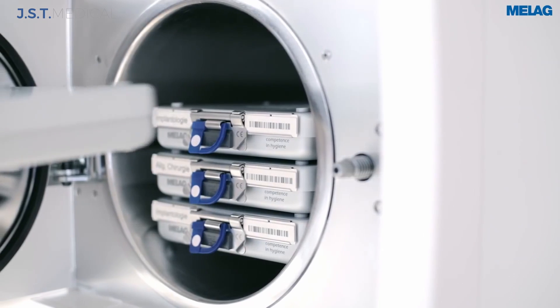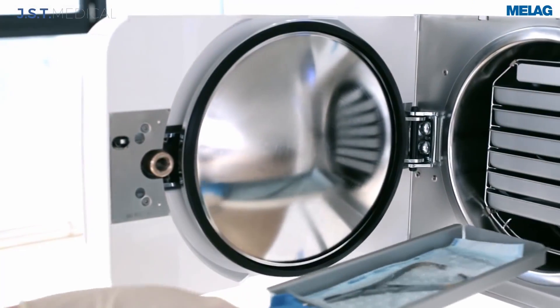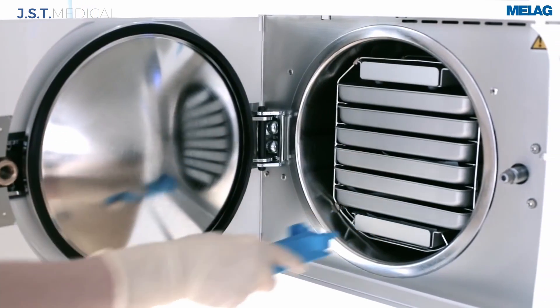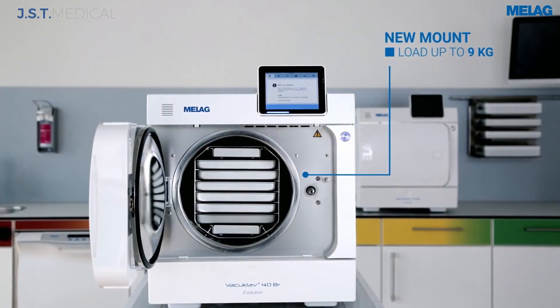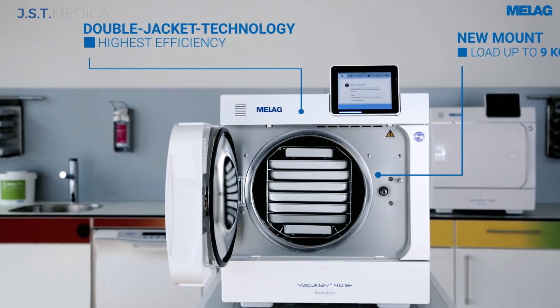With the optional Miele Store box system or the standard 8 trays, the autoclave can process up to 9 kgs of instruments. Miele's double-jacket technology holds steam around the entire chamber ready for use, which facilitates fast cycle times.